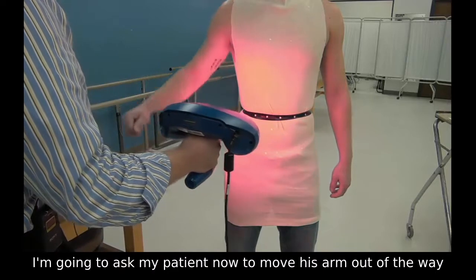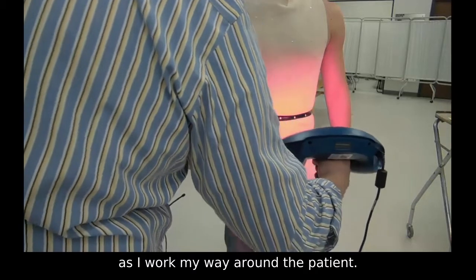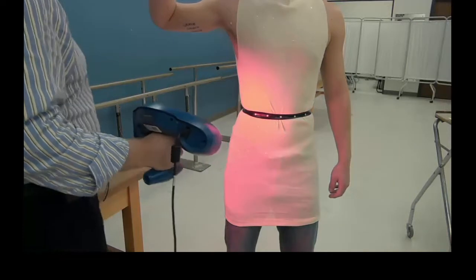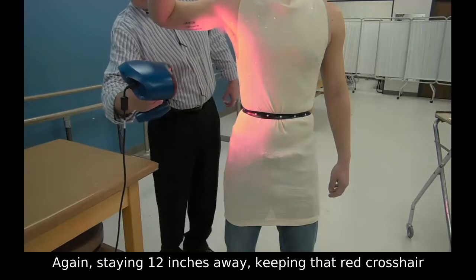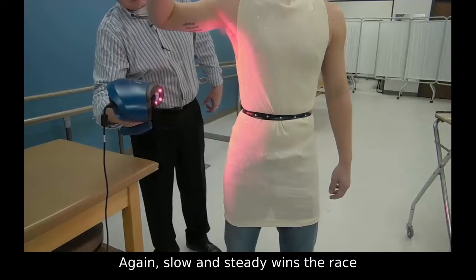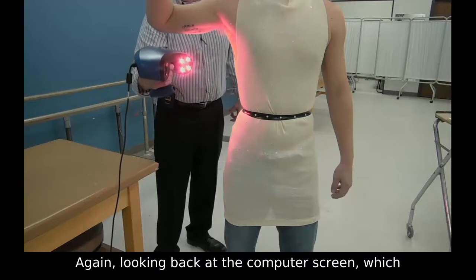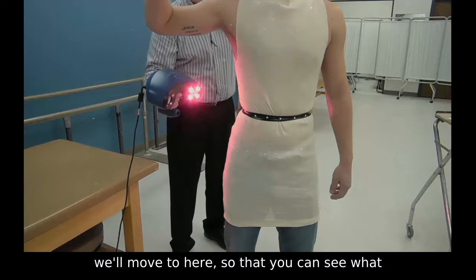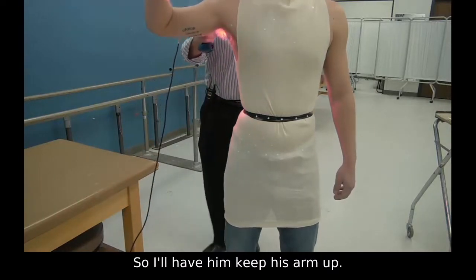Okay. I'm going to ask my patient to move his arm out of the way as I work my way around the patient. Again, staying 12 inches away, keeping that red crosshair on the patient at all times. Again, slow and steady wins the race when it comes to scanning with the Omega system. Again, looking back at the computer screen, which we'll move to here so that you can see what we're actually collecting in terms of data. So I'll have him keep his arm up.